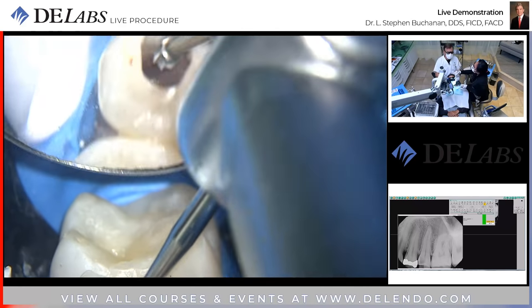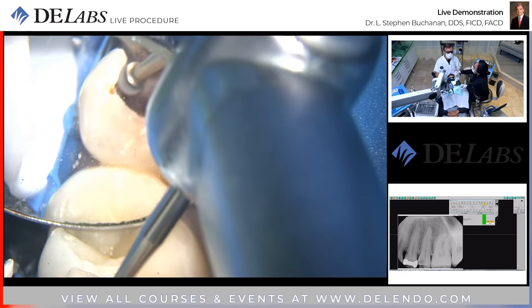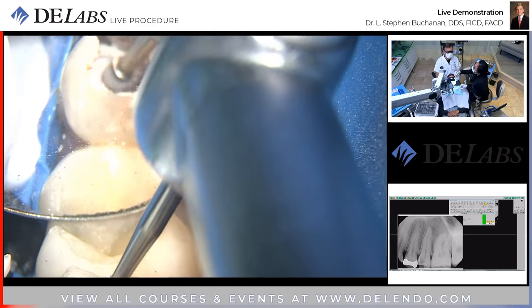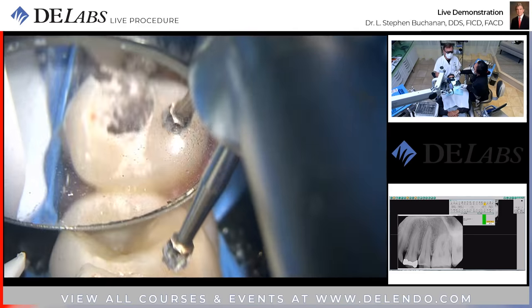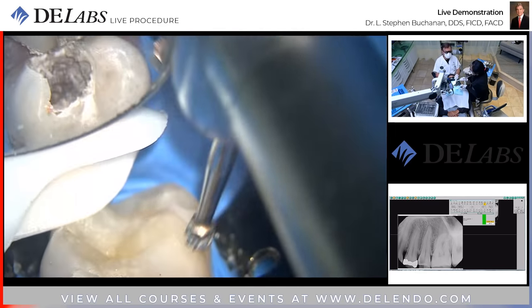So I'm going to cut the enamel back. And then I'm going to switch to a new burr. I haven't used it before. This is an SS White burr. It's a conservative caries removal device. Come in from down below. I can't see this.